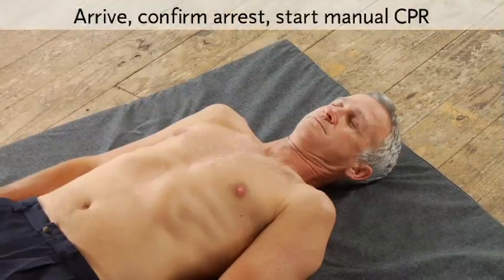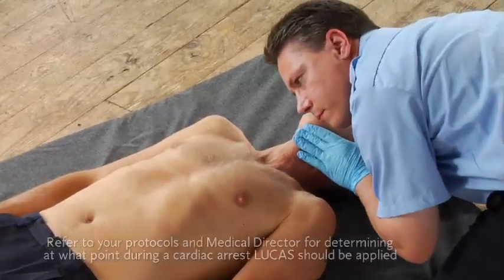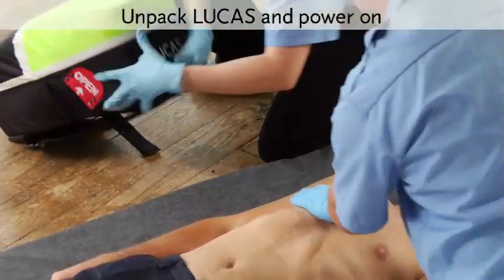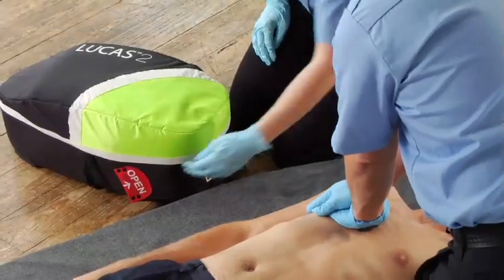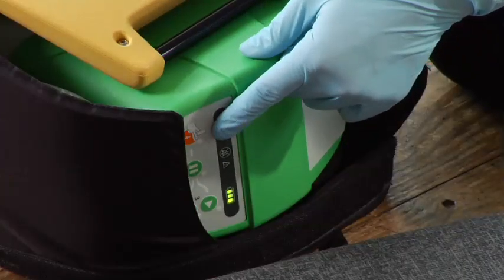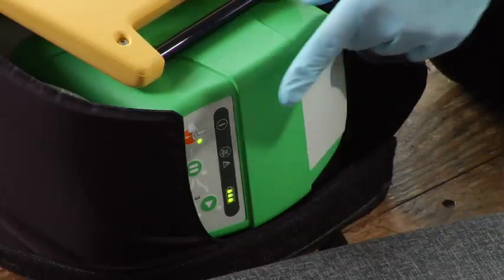Just like with manual CPR, when you arrive at the patient, confirm cardiac arrest and start CPR according to your protocols. If someone is already doing manual compressions, offer to relieve them. Now get out Lucas. Put the backpack down with the top towards you and open the bag. Before you take Lucas out of the bag, push and hold the on-off button until it turns on. It self-tests, and you see the green LED when it's ready to use.